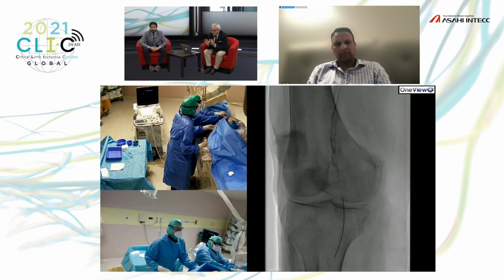My impression: the speed of this video, of course, is not the real one. I tried to reduce the time, because I spent probably more than 20 minutes to cross this occlusion. Many attempts. It was not easy to understand the direction, to change the direction, because the wire maintains the bend in the tip in the middle of the occlusion.